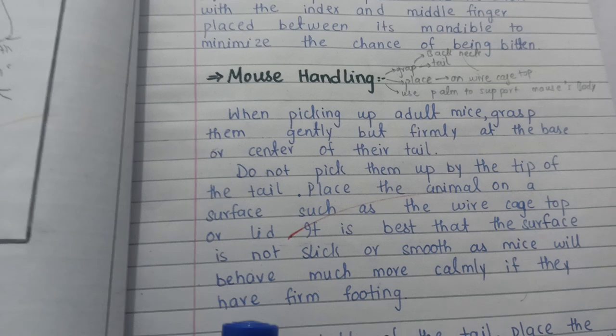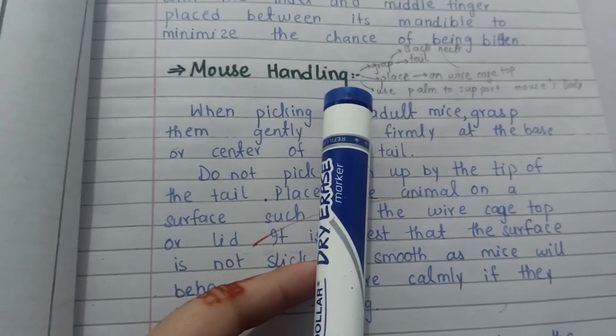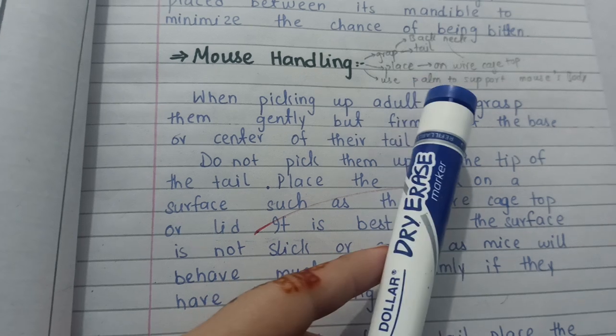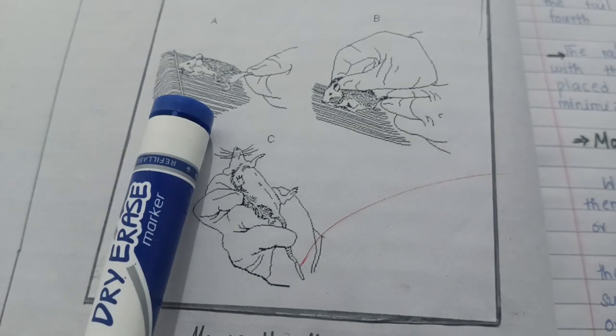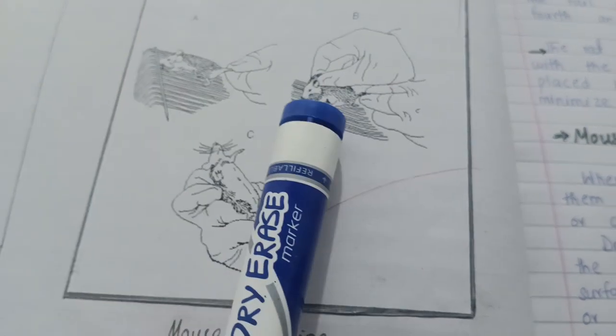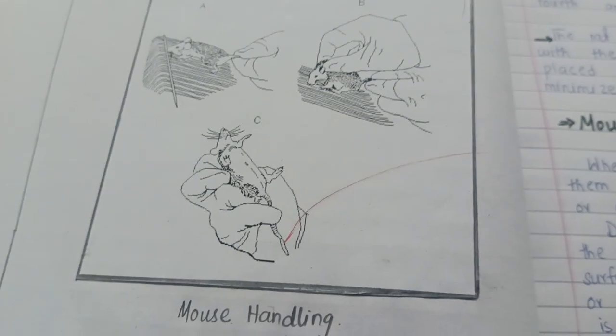Next is the handling of the mouse. Same, you have to grab the mouse by the tail and the back of the neck. Place it on the wire cage top and support it with your palm. Here the picture shows you have to handle it by the tail. Then you grab the back of the neck and support the mouse.